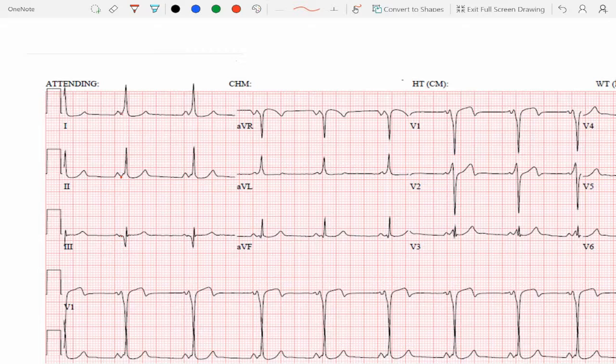And that's why you see the fusion between the pathway conduction and the AV node conduction. Go ahead. So why is it that these patients then will have the symptoms of palpitations and heart racing? Do they actually slip into an arrhythmia? Right. To answer that question, the answer is yes. Okay. But I want to focus a little bit on the delta waves so that we can understand why that happens.